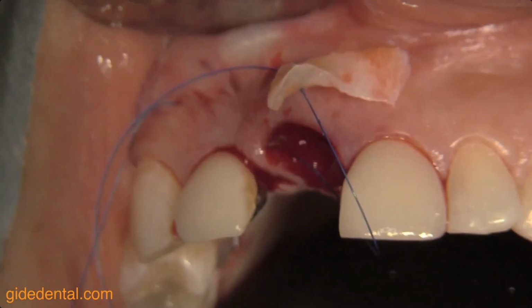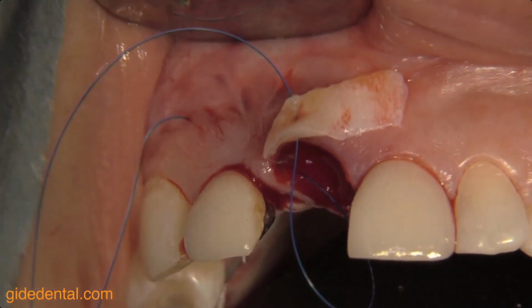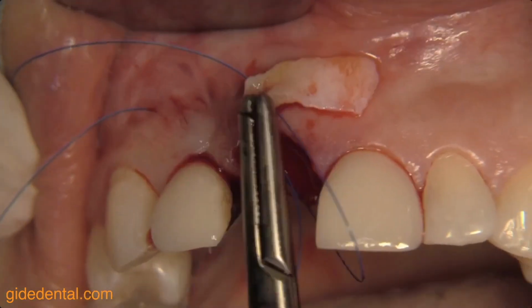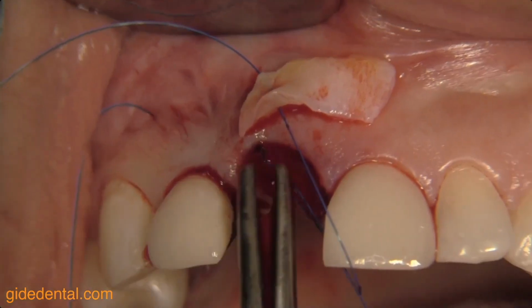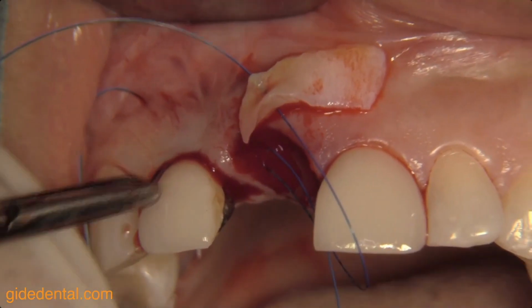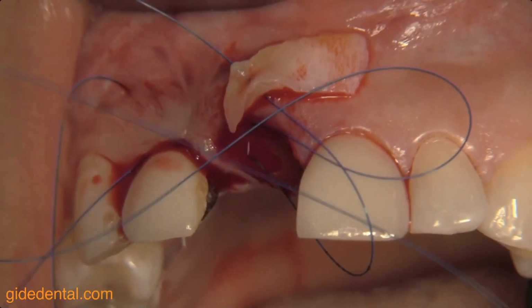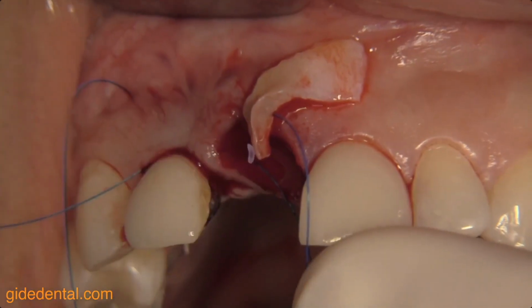And now the next step is that I'm going back with the needle in the same reverse position. So I'm coming now from the extraction socket, and I'm exiting through the sulcus. So that's just a reverse step. And I'm looking for the sulcus. And I think, yeah, I found it. Here's the needle. I'm pulling the needle out. I like to go reverse so I don't have the sharp side of the needle, because it will grab some tissue. And now I'll start to have the suture there.